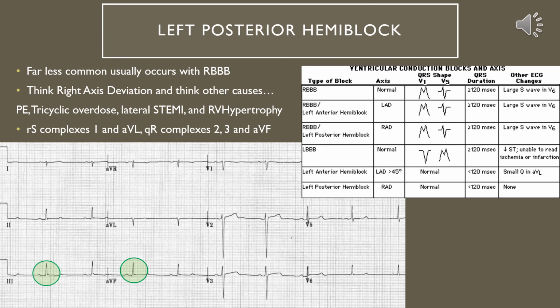On this slide, I have some ventricular conduction blocks and axes to think about, whether it's the M or the W, and how wide the QRS complex is. I think this is helpful to think about the different ventricular conduction blocks that we have just talked about.